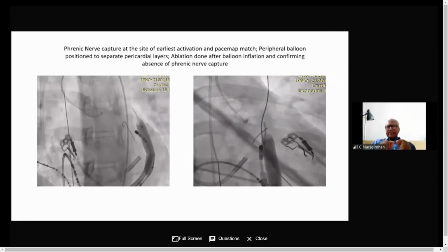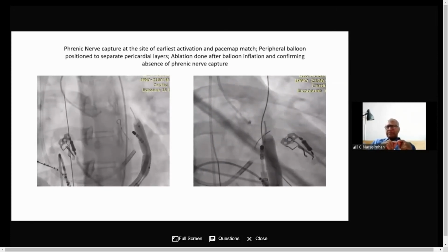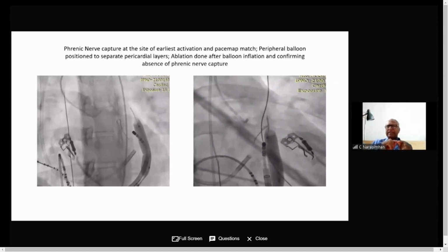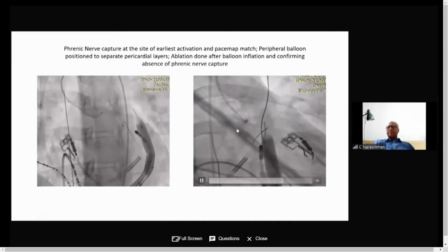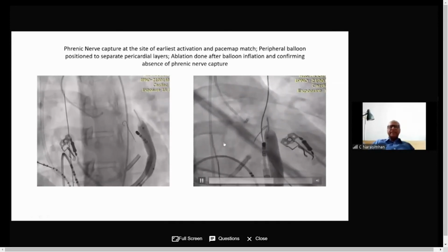Second thing is, even if you get into the RV, generally nothing happens. You aspirate immediately, you keep the wire inside, you can immediately come back a tad and advance the wire. Generally nothing happens. Because patient is not heparinized, and these patients just delay the heparinization.